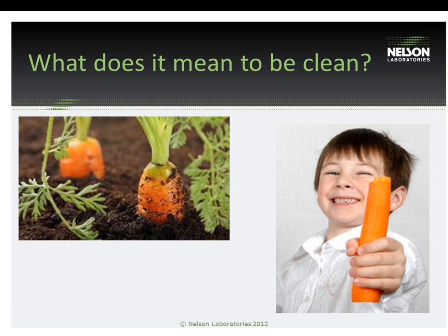And so, like with medical devices, these cleaning validations are really important to remove these residues before they see the patient. An important note to remember with these cleaning validations and why they're so important is that just because something is sterile and goes through a sterilization process doesn't mean that it's necessarily clean. So these cleaning validations are very important to assess the cleanliness of these devices before they're implanted into patients.